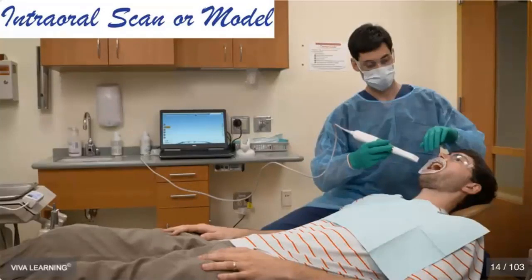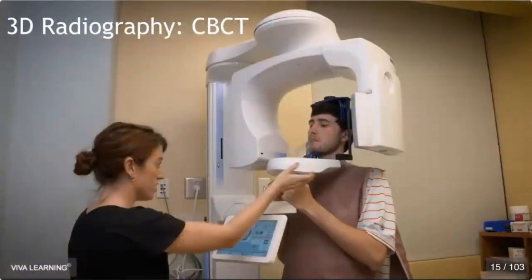For people like myself on the surgical side, this is kind of a big leap, and this is something that we've had to learn to incorporate into our practice. We're really catching up with the restorative guys, but a good quality intraoral scan is really important. And that includes the arch that we plan to restore and place the implant on, as well as the opposing arch and a good bite registration, all of which are really important. And a high quality CBCT scan.